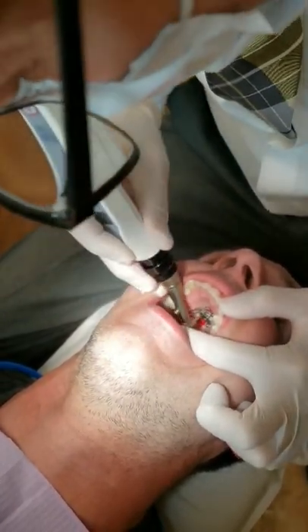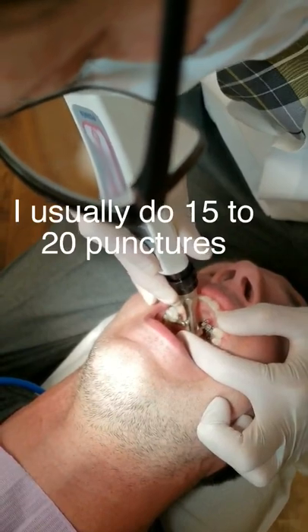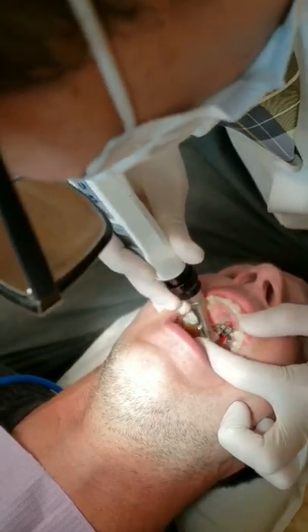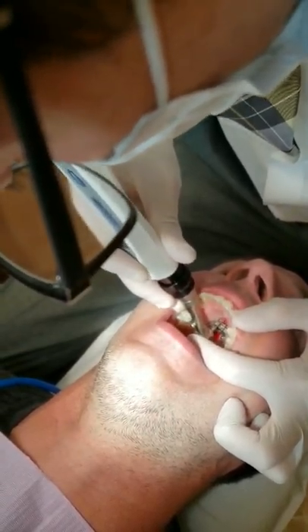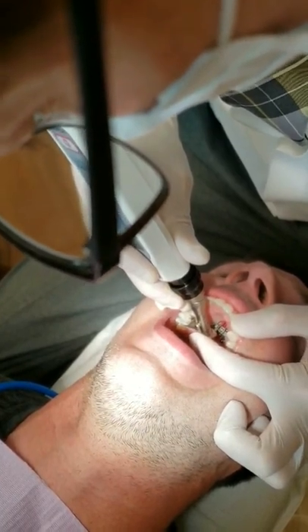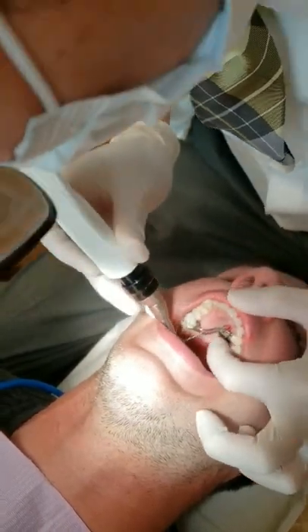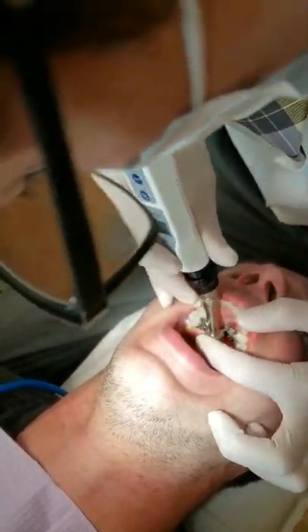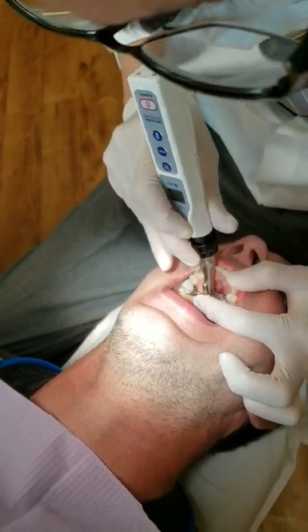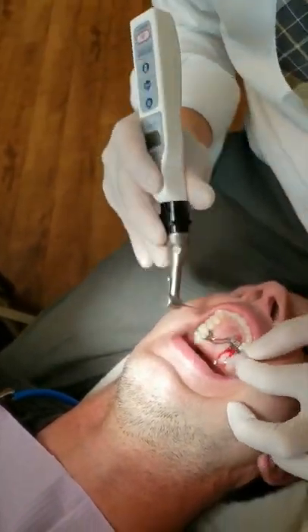We did five so far. Number six. Number seven. Number eight. Usually, once I feel the drill bit start sinking in, that's when I stop.